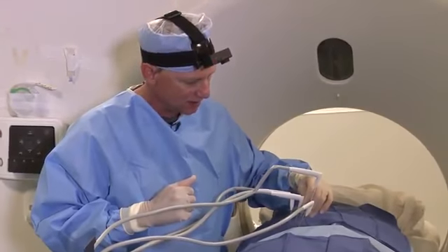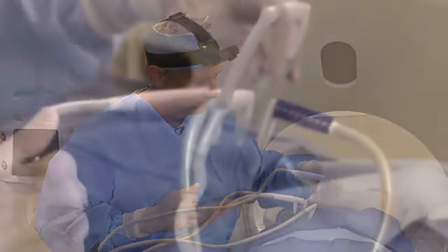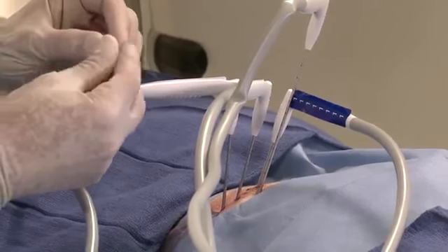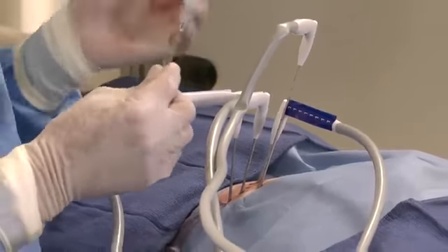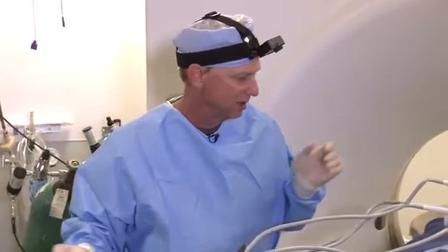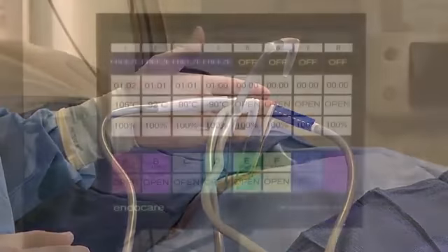So I'm going to go ahead and remove the guide needle. I haven't removed it to this point with the thought that maybe if I pulled it out, the lesion would bleed. I don't think that would happen. Again, you want to make sure that you reinsert your stylet so you're not pulling a hollow needle out of the tumor. It's interesting to me that we ended up with 4 probes. I'm really happy with the way they're placed.